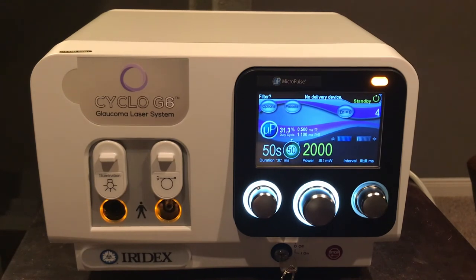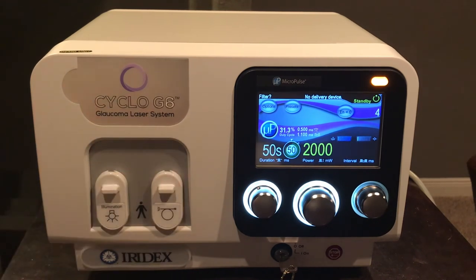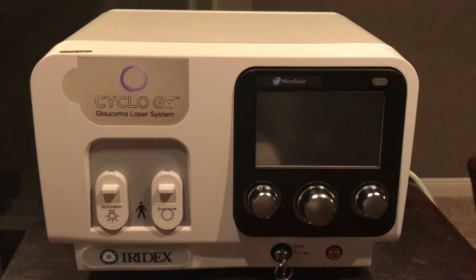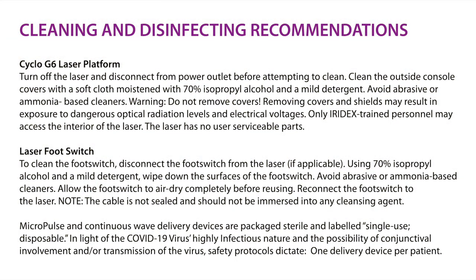At the end of the day, for cleaning and disinfecting the Cyclo G6 and foot pedal, use 70 percent isopropyl alcohol. Close the ports on the laser, turn the laser off, and disconnect the power from the wall. You can then safely wipe down and disinfect the laser, leaving it ready for the next patient or the following day's use.